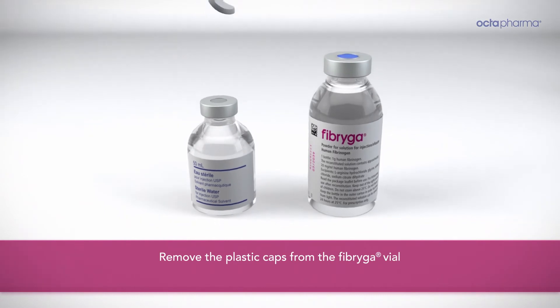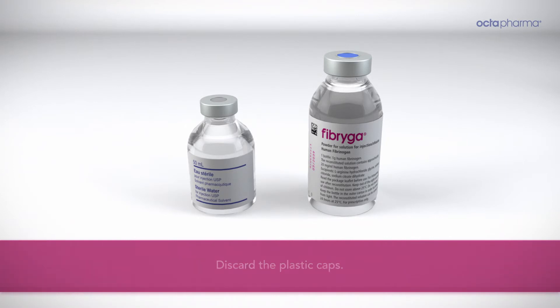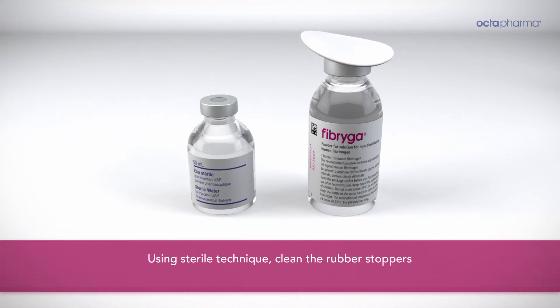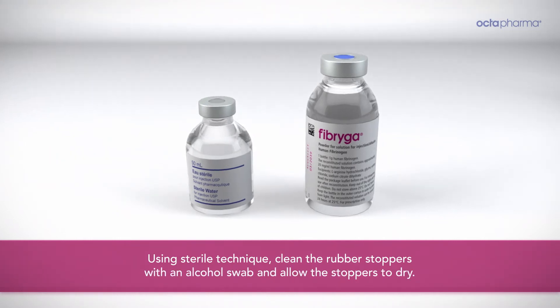Remove the plastic caps from the Fibriga vial and the water vial to expose the rubber stoppers. Discard the plastic caps. Using sterile technique, clean the rubber stoppers with an alcohol swab and allow the stoppers to dry.